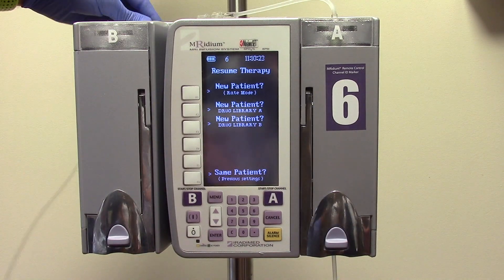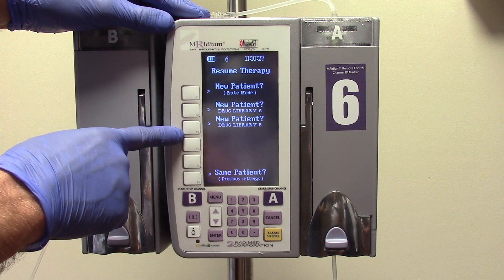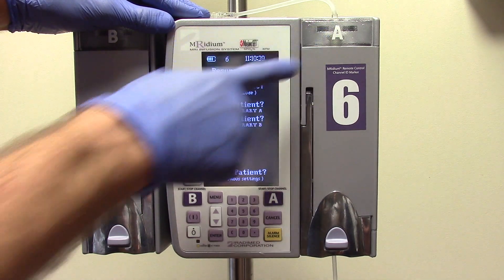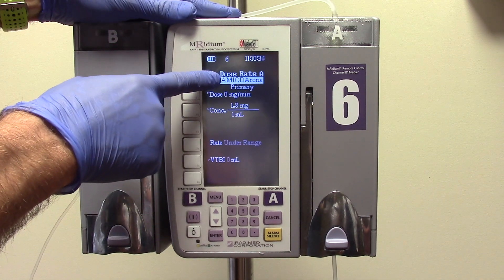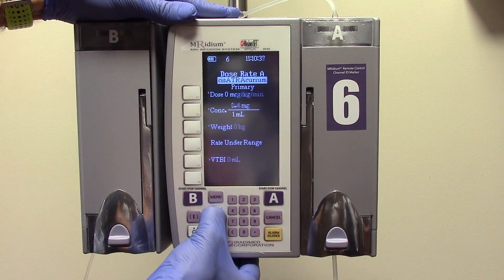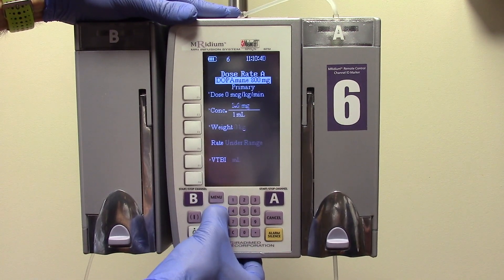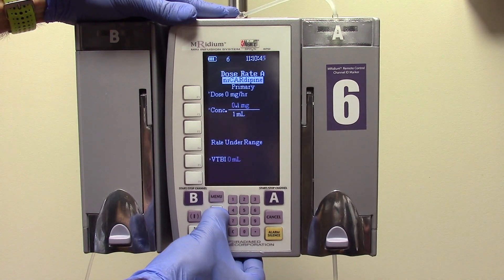The menu screen offers new patient rate mode, new patient drug library A, and new patient drug library B. We will now program channel A. Press the soft key next to new patient drug library A. The selected medication is highlighted at the top of the screen. To choose a different medication, use the arrow keys and scroll until the desired medication is highlighted. They are in alphabetical order by generic name.